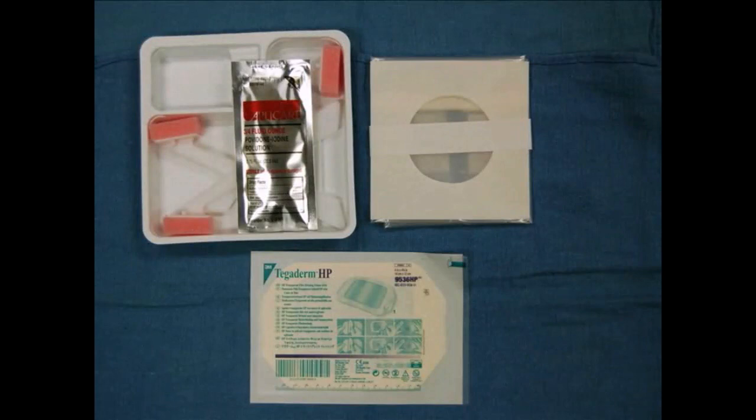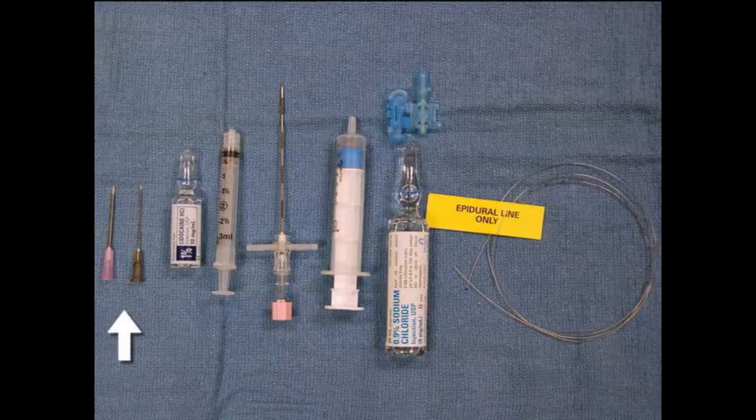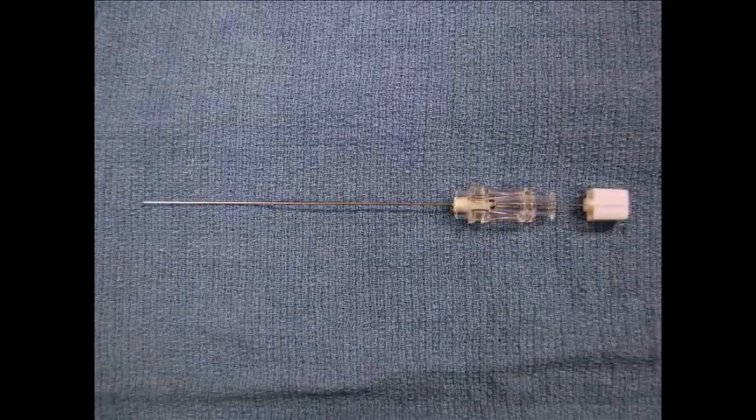Required equipment for the combined spinal epidural includes a betadine prep kit, sterile drape, and tegaderm. You will also need a sterile mask and gloves. You should obtain an epidural kit that contains 18 and 22-gauge needles, 1% lidocaine, a 3-milliliter syringe, an 18-gauge Tuohy needle, a loss-of-resistance syringe, sterile saline, a lure lock, and a 20-gauge epidural catheter. Also obtain a spinal needle.